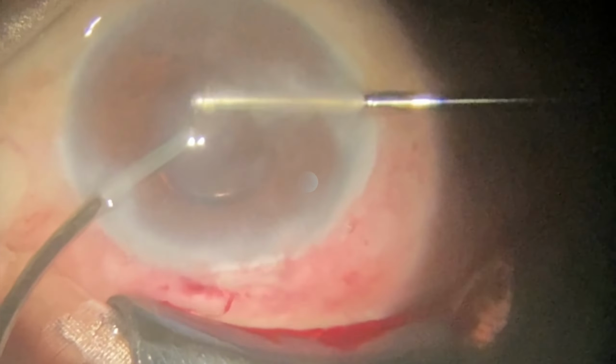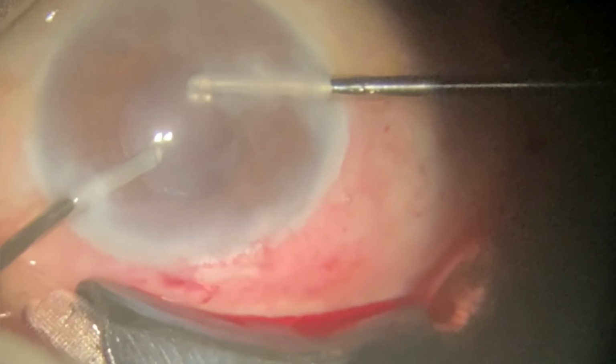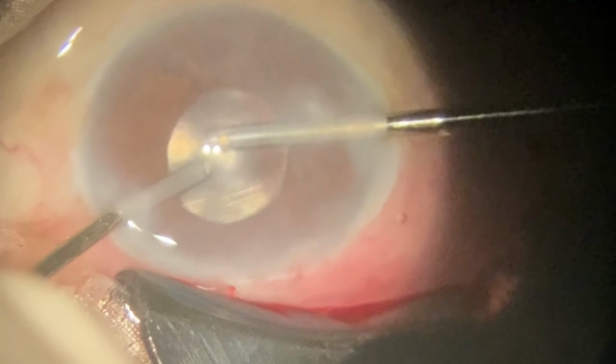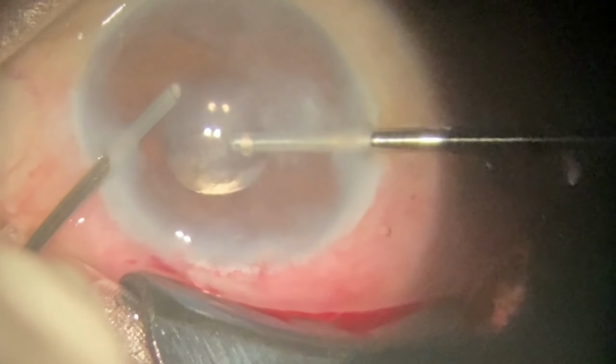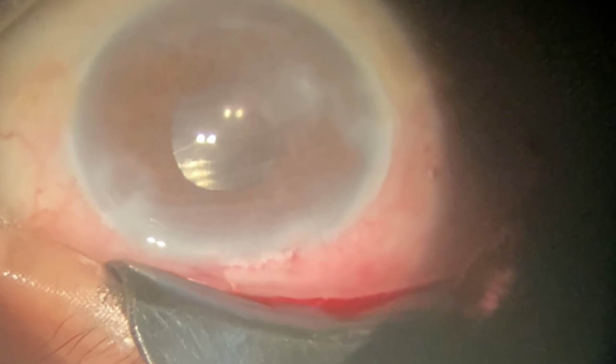There should not be any vitreous in the anterior chamber, so I am using bimanual vitrectomy probes to remove the remaining vitreous from the anterior chamber above the IOL and under the iris as well.